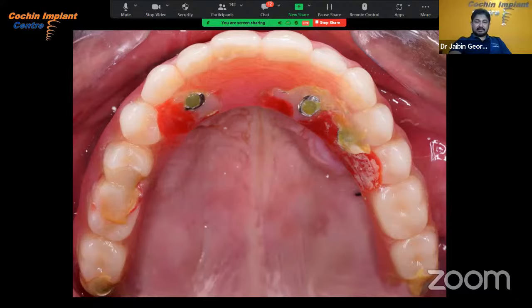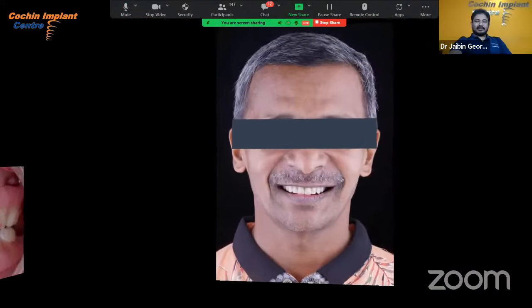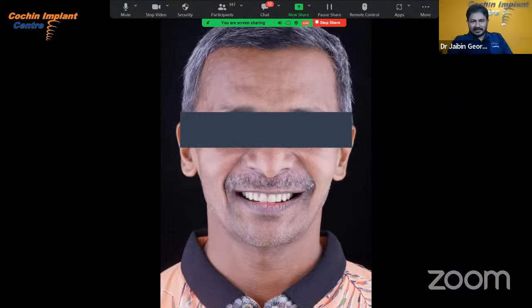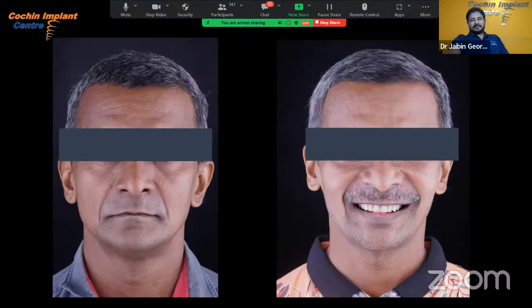This is fixed on the same day afternoon. You see the right occlusal, left occlusal, and the frontal view. And happy patient. Same day afternoon, patient left the office with a beautiful smile and fixed teeth. He was so happy. You see the before and after photographs. Before and after.